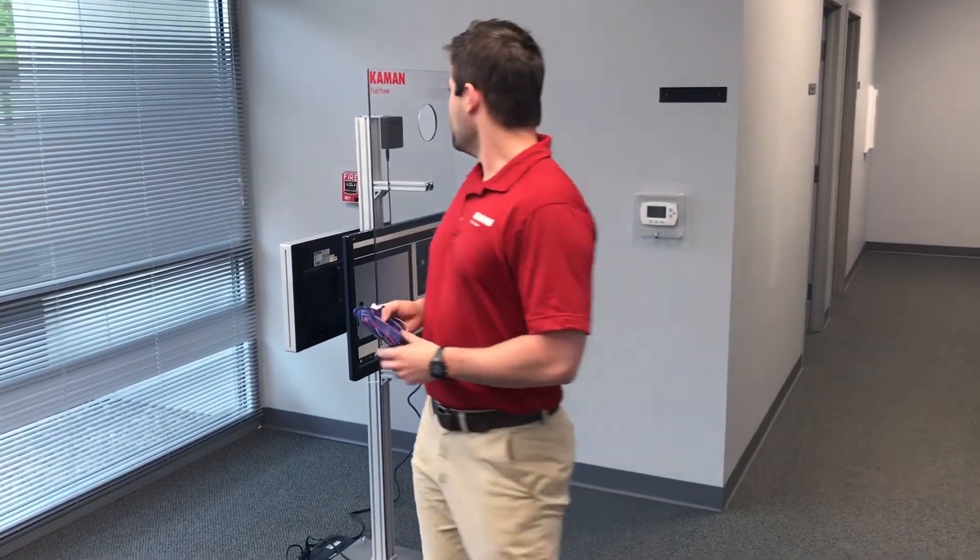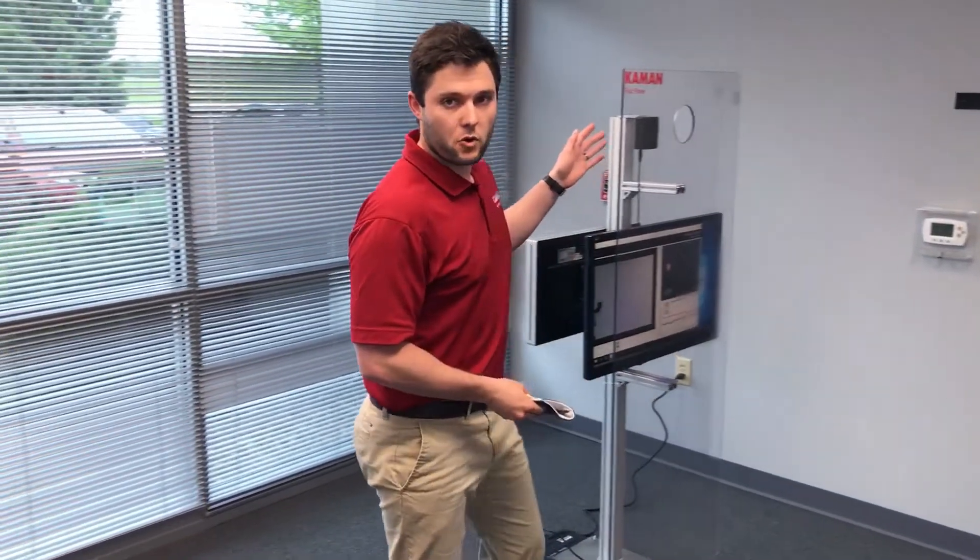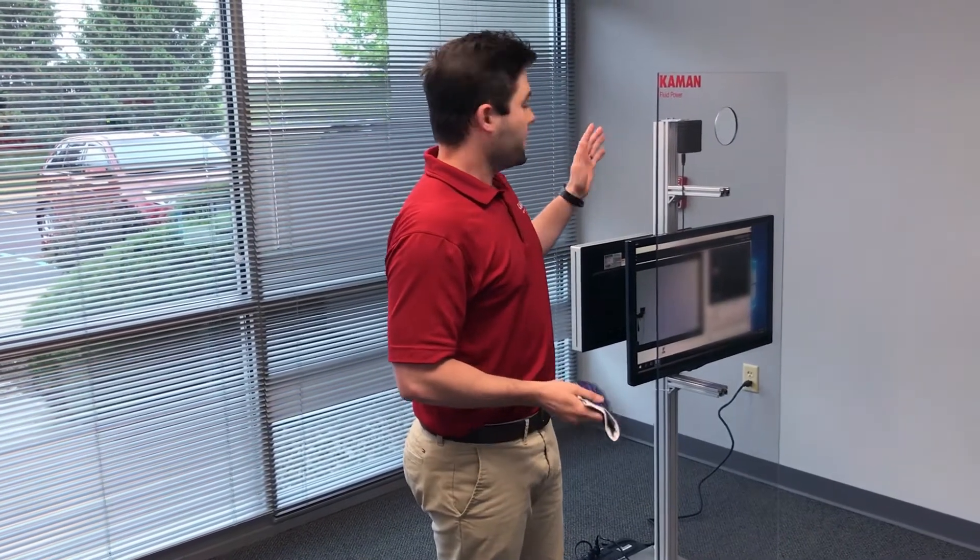Now if you pop hot — if you run above the 100.4 degrees Fahrenheit that the CDC recommends as a fever threshold — it gives a buzzer sound and you report to HR or health and safety officials for further screening or instruction.